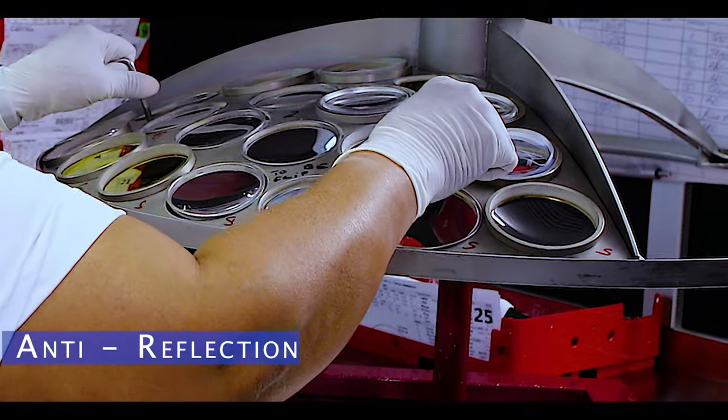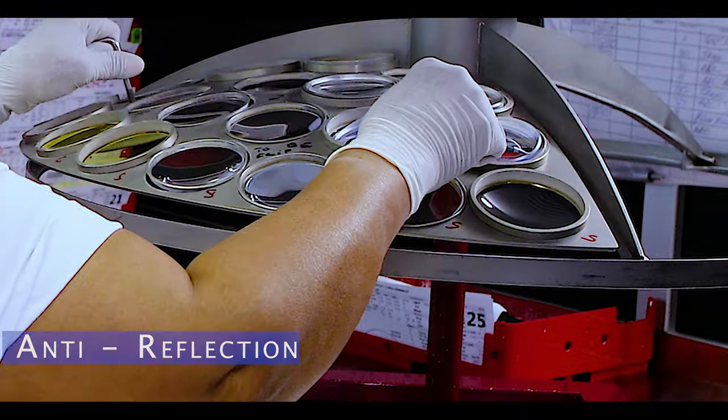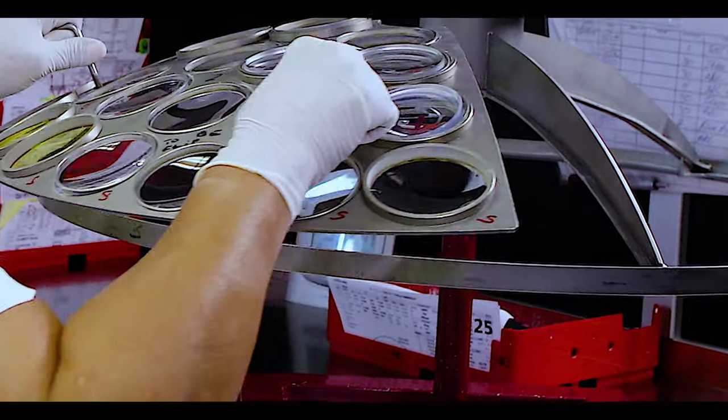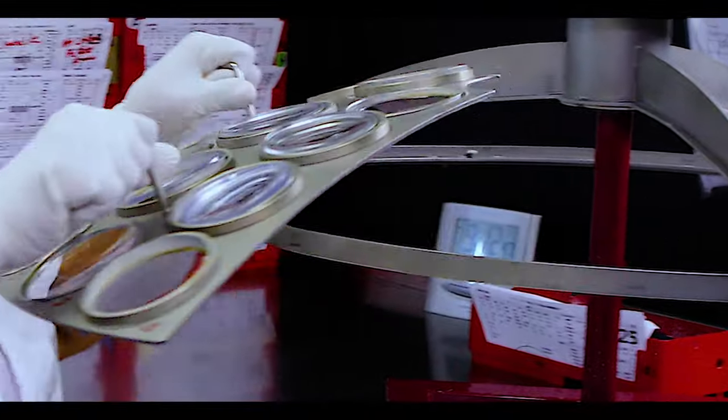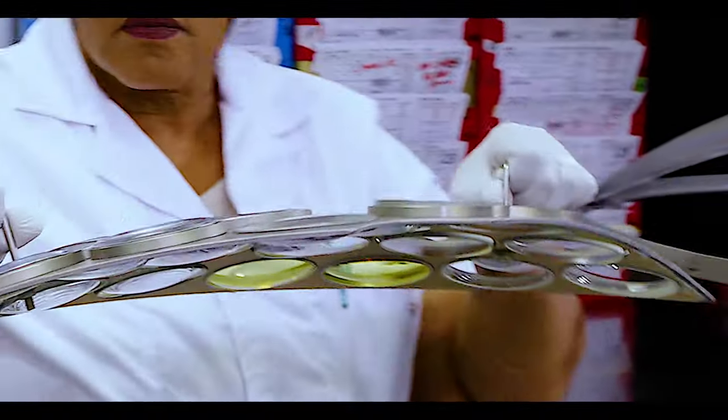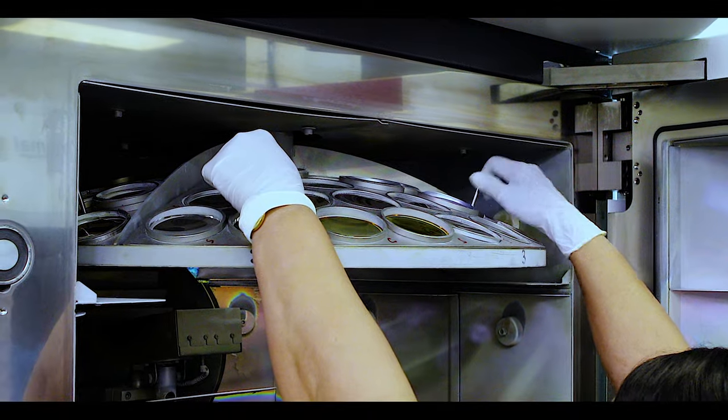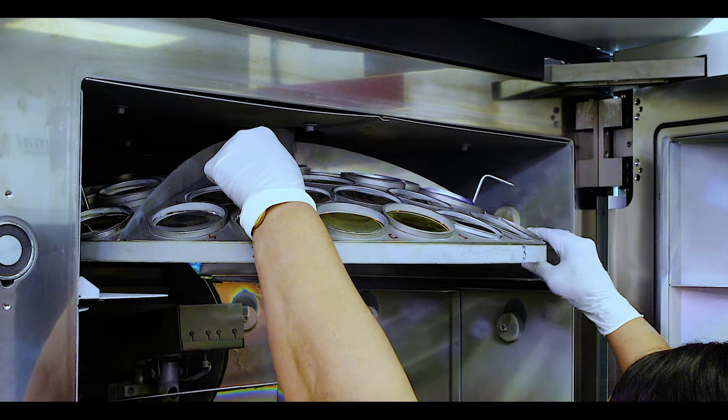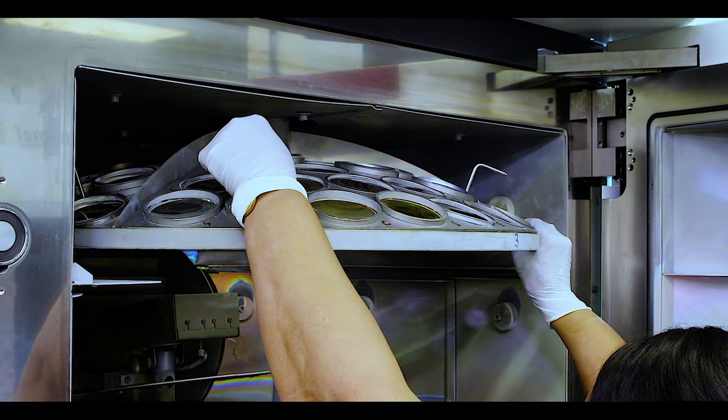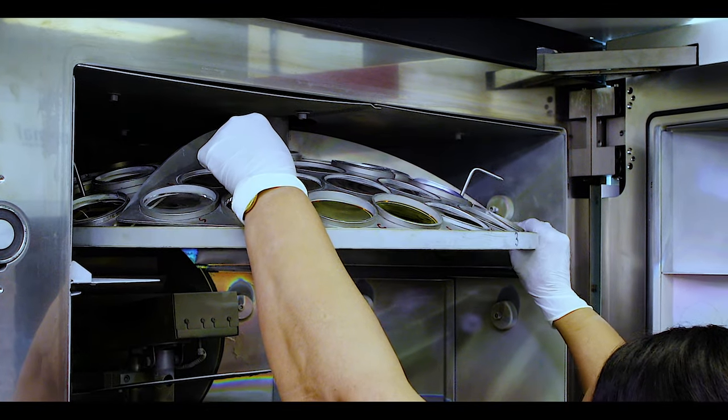Once the lens hardening and curing process is complete, the lenses are inspected again and individually loaded and put into an anti-reflection coating lens holding chamber device.